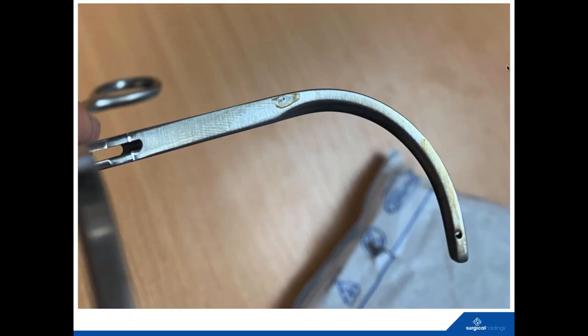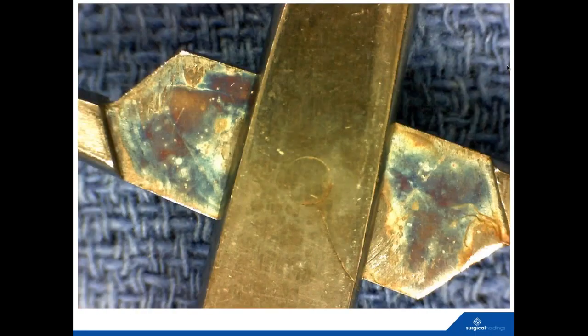worse. So not only are you worried about the device snapping, but of course you're also how can you assure that you're sterilizing in that hole, which I'm not a sterilization expert, but I'd question if that's actually achievable. Very much. That's where we need Hank on, I think, to give us that bit of input there.